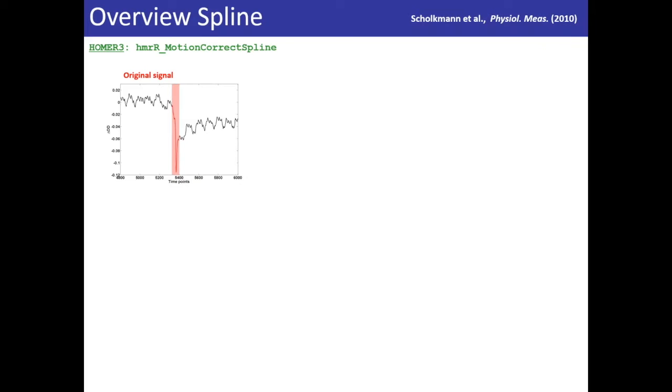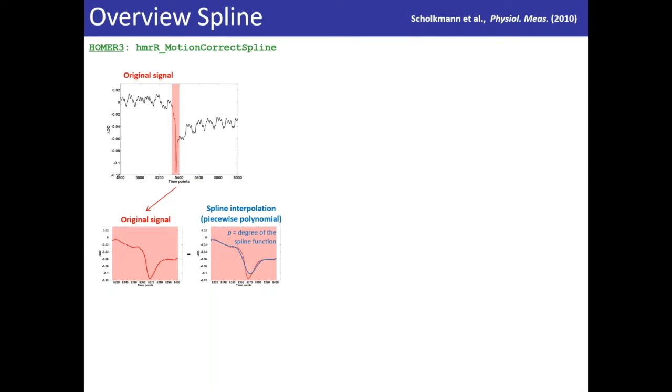The red patch here is the motion; the rest looks clean with the intact heartbeat signal. So we have this motion artifact, and in the rest of the signal you see a nice heartbeat. Let's zoom in. This is our motion artifact. What spline correction does is fit a polynomial to this motion artifact, seen as the blue curve here. The next step is to subtract the fit, or the model signal, from the original signal, and the magenta shows the corrected signal.